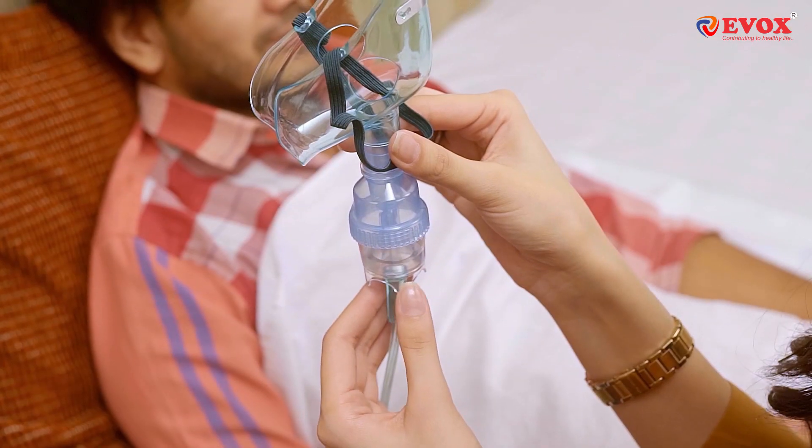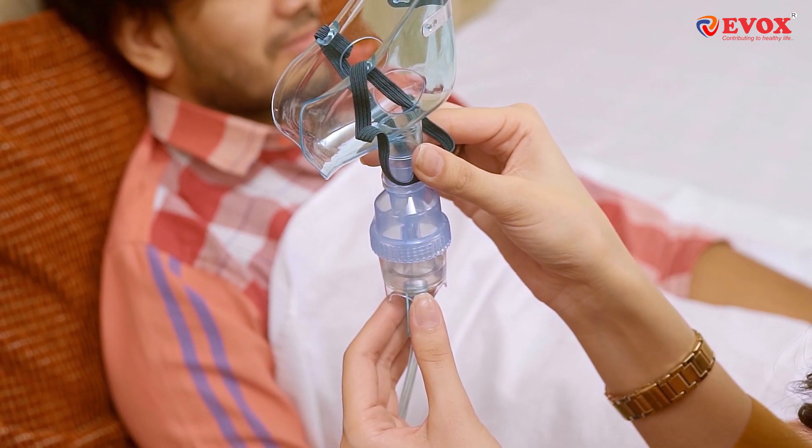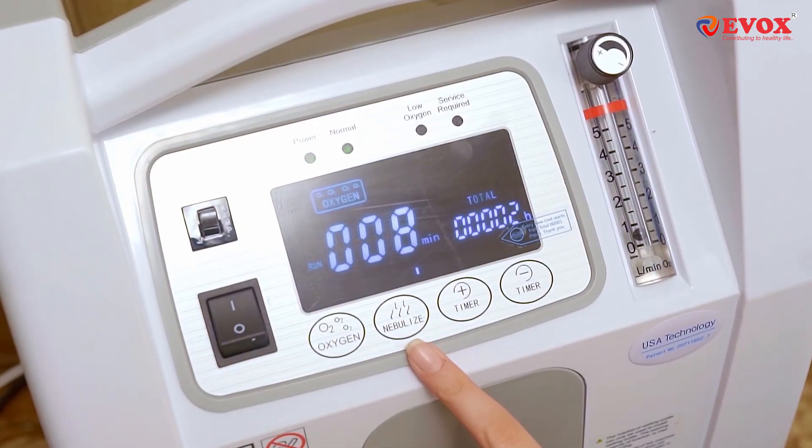Now add the nebulizer medicine to the nebulizer mask, and then press the nebulizer button on the concentrator.